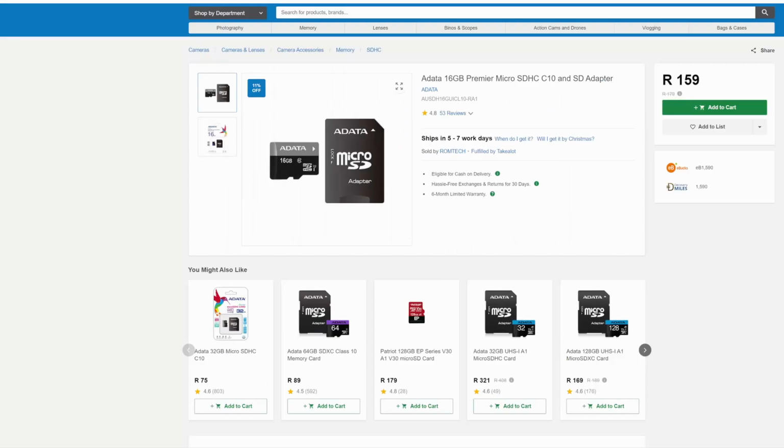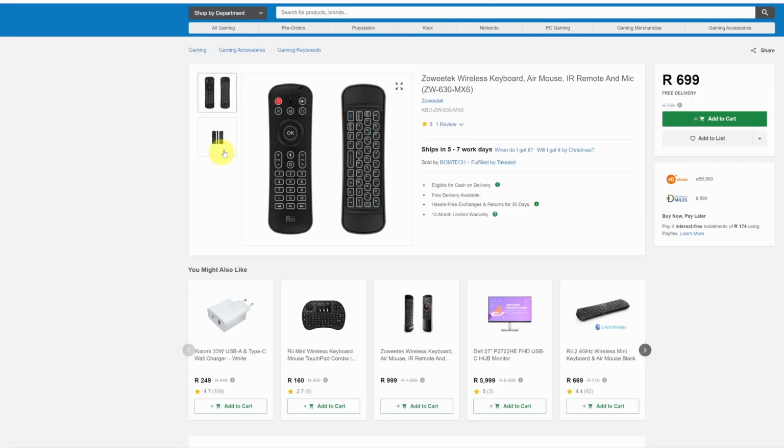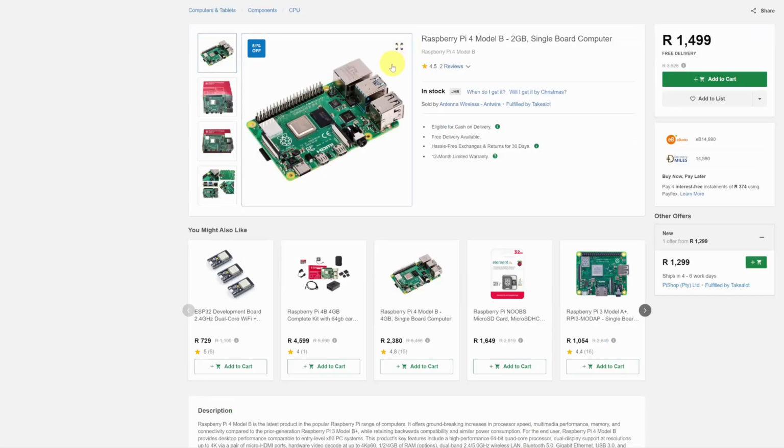And then all you do is you take this SD card and you plug it into your Raspberry Pi. You power it up with a USB-C cable. Often the monitors have USB, so you can just plug it straight from your monitor into there to power it from the monitor. And then you plug the SD card, the USB. There's a USB that comes with this that just gets plugged into one of the USB ports, and then you power it up, and it should run.